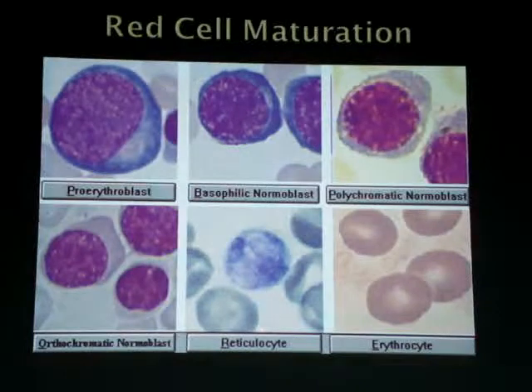So, the next cell in the lineage is a reticulocyte. Who among you here are medical technologists? What stain is used to identify retics? Vital stain, brilliant cresyl blue. You will be able to see blue granules in its cytoplasm. These granules represent the remnants of the mRNA and the rough endoplasmic reticulum in the cytoplasm, indicating that there is still ongoing hemoglobin synthesis.